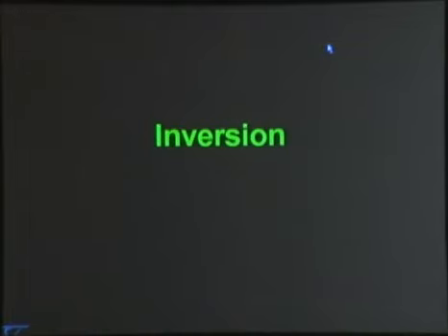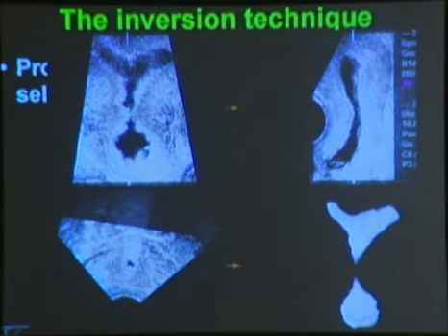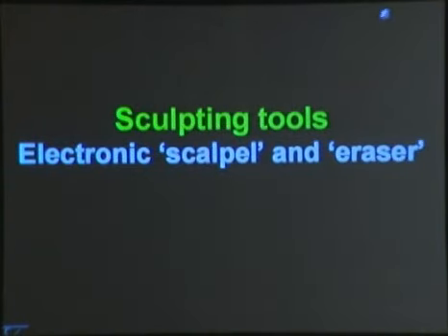The inversion mode was already mentioned, and that is obtained by practically rendering the black areas into white. Barry talked about it, and I will show you many examples of that also.